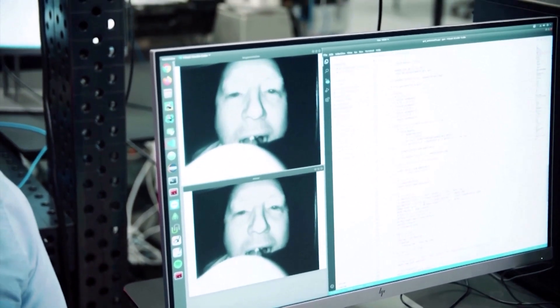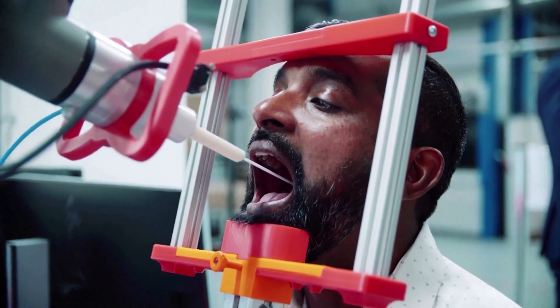The robot takes the swab and identifies the swabbing area in the throat of the patient, makes the swab, and conceals the sample in the container. This is to help the healthcare system in collecting the samples.